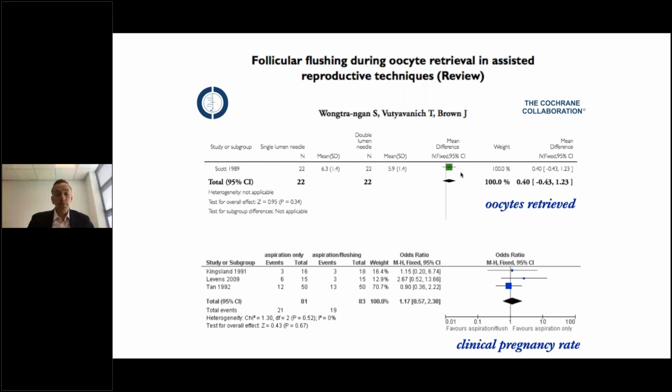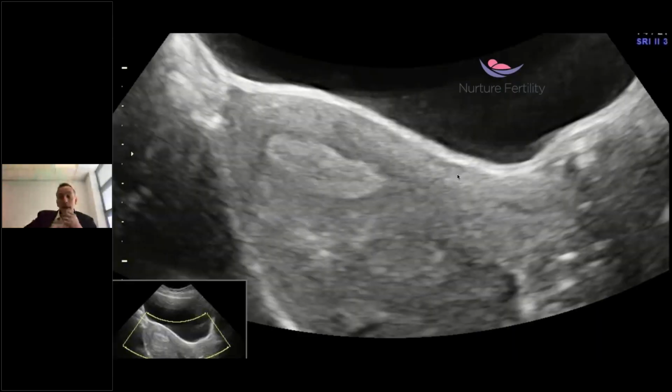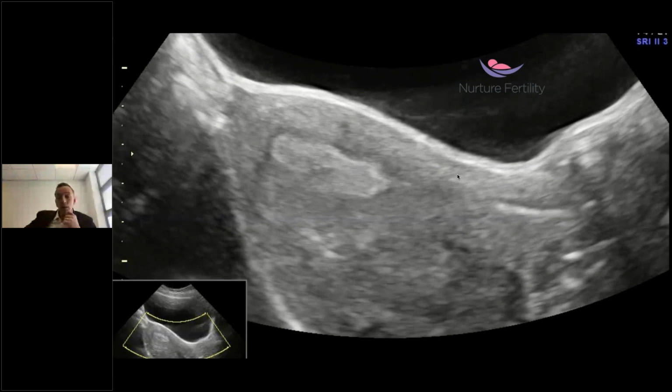And I'll finish on this one, embryo transfer. So I think it's a nice way to finish. It all builds up to getting the embryo and putting it back. Very straightforward. Few studies say ultrasound is not important, it doesn't help.